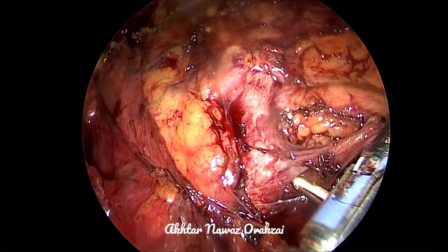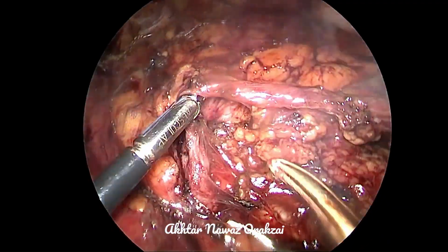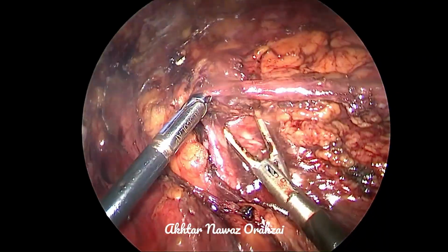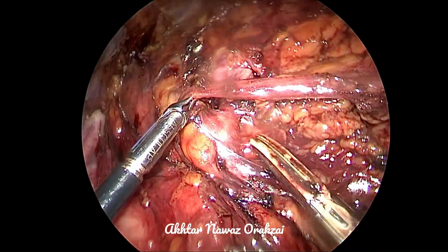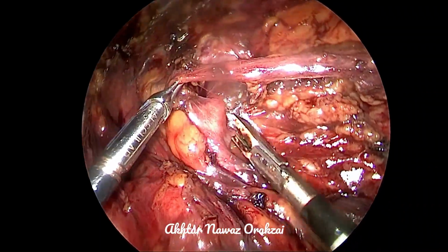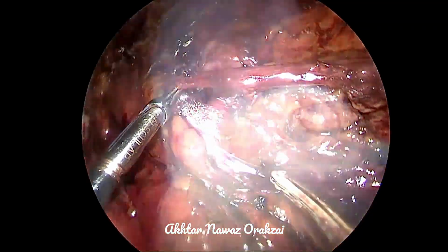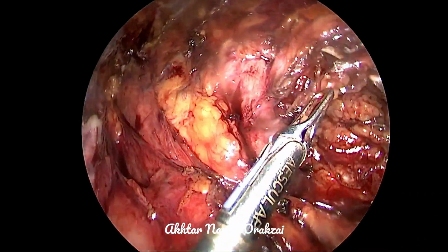It is usually safe, in case of a non-functioning kidney, to dissect lateral to the gonadal vein and not come to the medial side of it, because if you are dissecting medial to the gonadal vein, there are chances that we will encounter the lateral wall of the aorta.